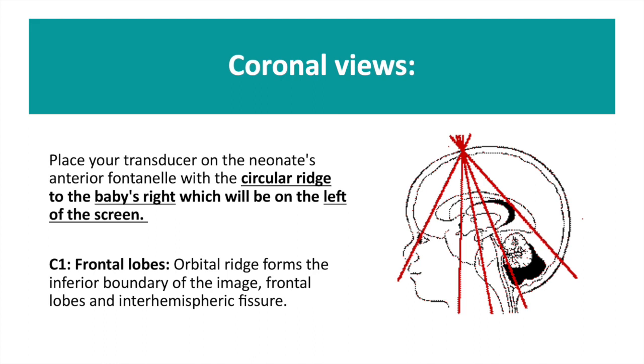Place the transducer on the anterior fontanelle with the circular ridge to the baby's right side. This will then correspond to the left hand side of your screen.